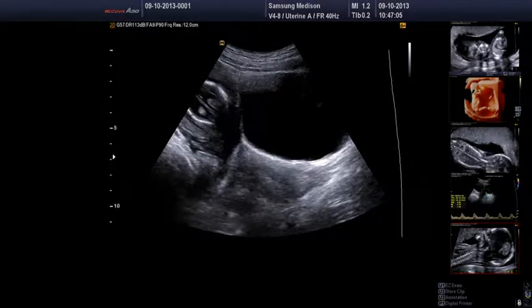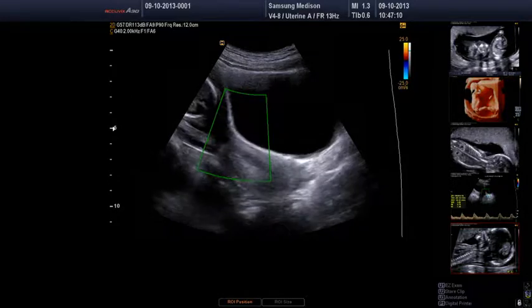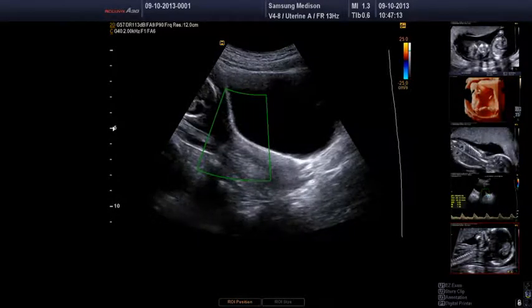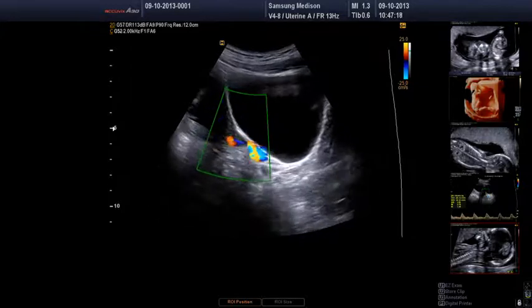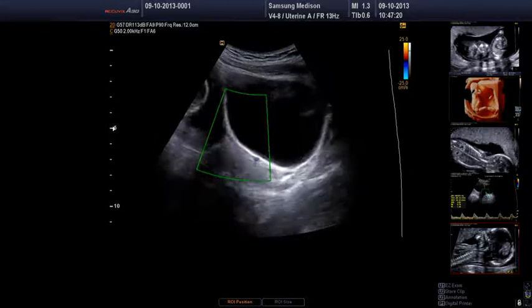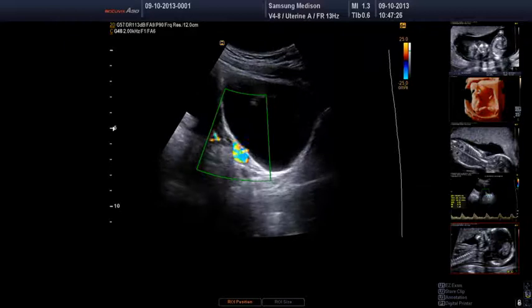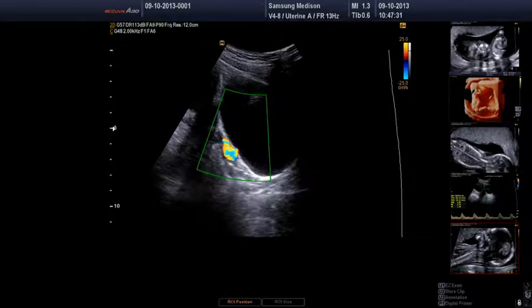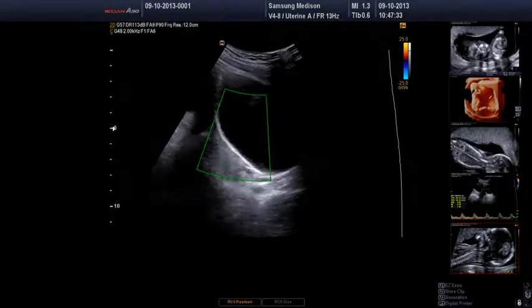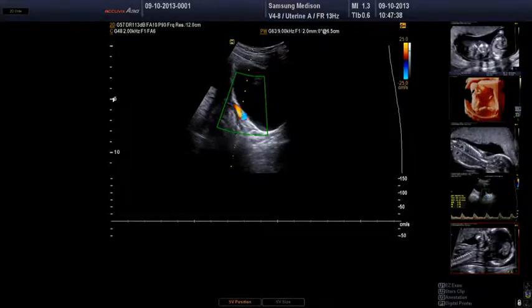If we wanted to just come on to look at the Dopplers, if I start in the midline, I'll put some colour on here, sorry. Okay. And then just work my way, so I've rolled off the cervix laterally, and then I can see my uterine artery there, and I'm just trying to improve angulation. I'm trying to pick it up at the level of the cervix. You can see, come back to the midline, that's cervix there. Missed it.